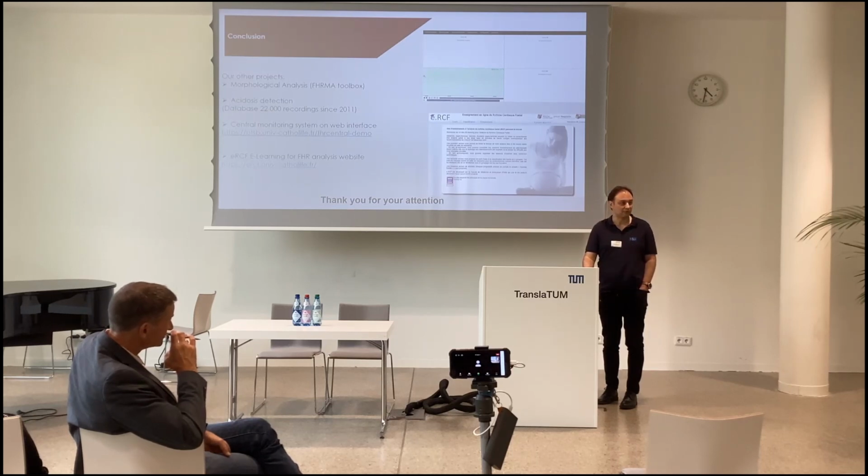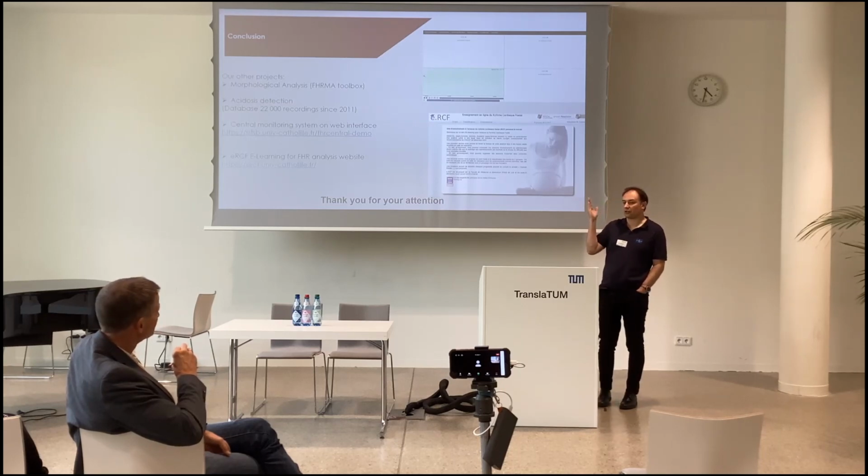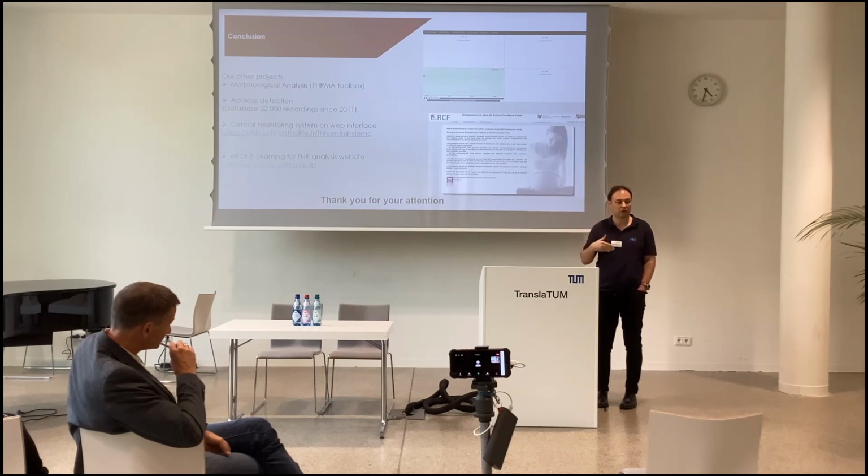But the assumption of your work is that you want to improve that Doppler signal, and you use the scalp as your ground truth, right? Yes, that's right. But we don't have enough dual signal datasets. There are only 100 dual signal datasets in the training session, and most of the recordings are annotated using only the fetal heart rate, the Doppler signal.